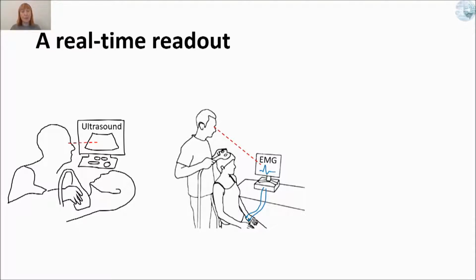In this case, the operator coarsely places the coil over the primary motor cortex and then slightly adjusts the precise location and orientation of the coil and the stimulation intensity until the electromyographic activity recorded from a target muscle satisfies specific latency and amplitude requirements.